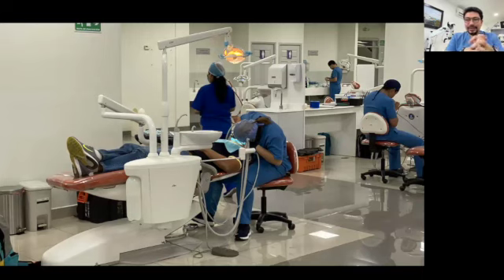Definitely not. She's trying to see inside of the mouth of the patient. She's trying to do her best. And she's trying to have a proper vision. Because of that, she is in that position. And that is not ergonomic at all for her. Can you imagine working like this for 5 years? You are working like this 5 years and you are done.